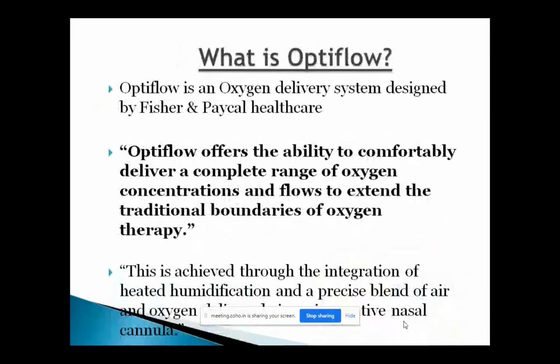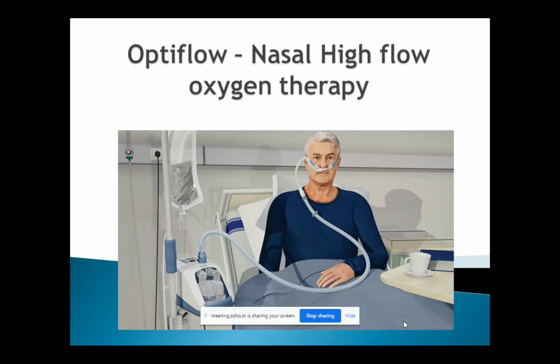If you go back to the previous picture, you can see the device. The bag of water goes into the chamber. That's what the humidification is. The chamber heats because you've got a heated plate on it, and that's where the air is heated and humidified. Then it comes to the patient by the big tube, and it goes into the patient via the nasal cannula.